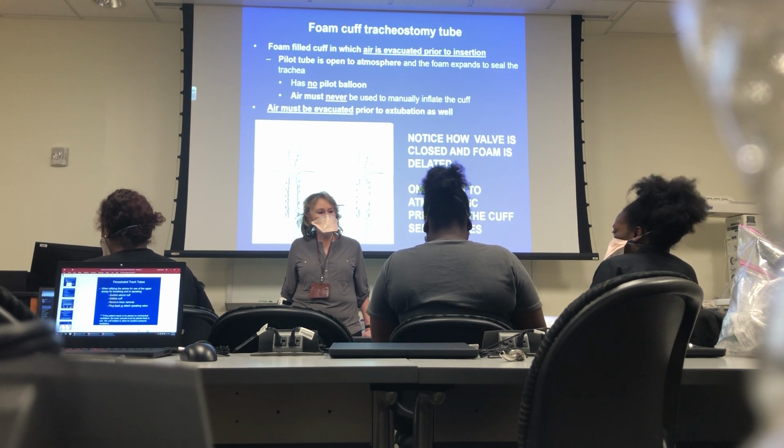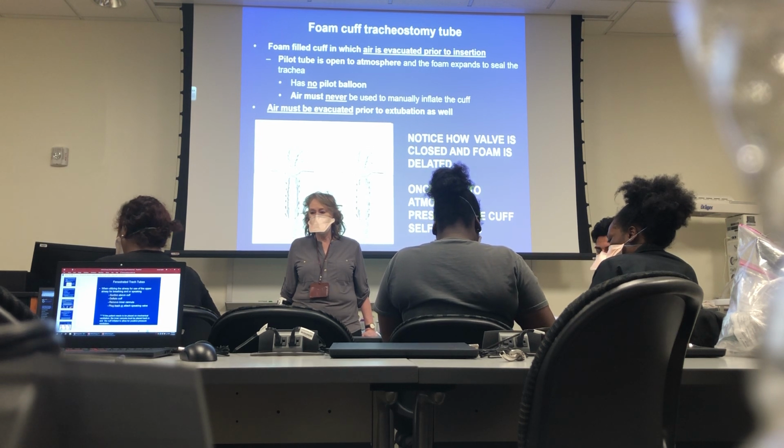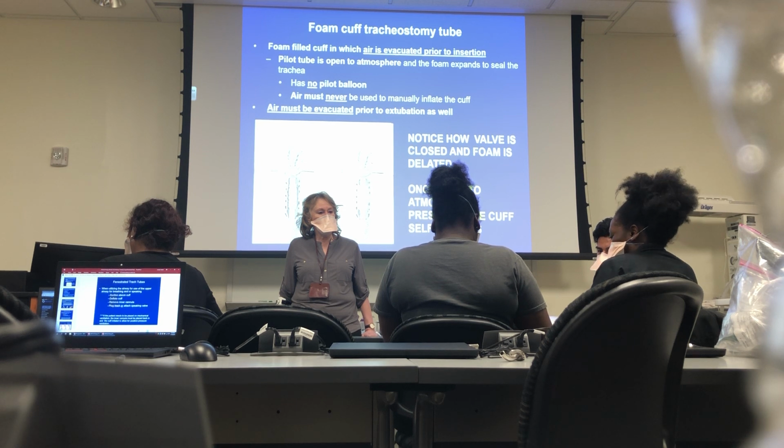Well, you are not deflated yet. Make sure you deflate it all. Oh, see? You let it go. That's the thing. There you go. So you have to keep deflating, but when you disconnect the syringe, you have to squeeze that red thing.